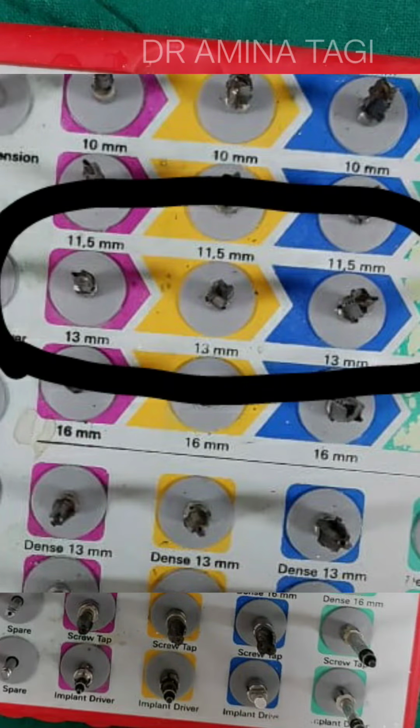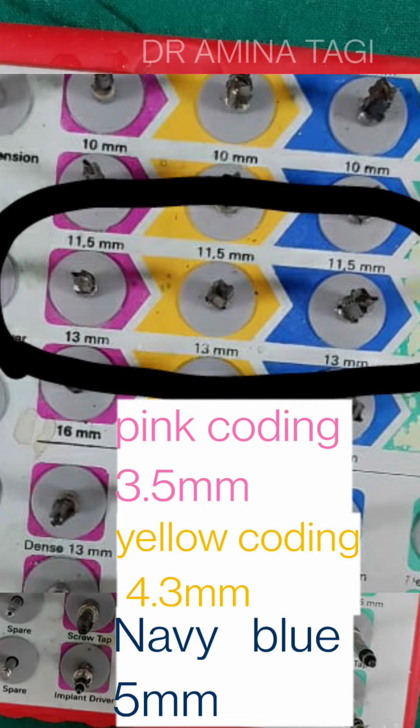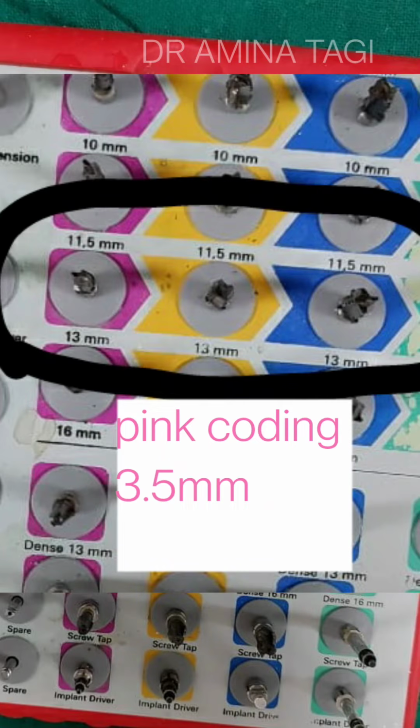So we have the diameters of 3.5, 4.3 and 5 mm. The pink color coding is 3.5 mm diameter, the yellow color coding is 4.3 mm diameter, and the navy blue color coding is 5 mm diameter. Since our implant is 4 mm diameter, obviously we have to take a diameter which is less than 4 mm. So 3.5 mm will be the most suitable, and this will be your final shaping drill.